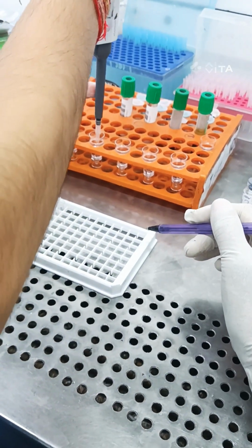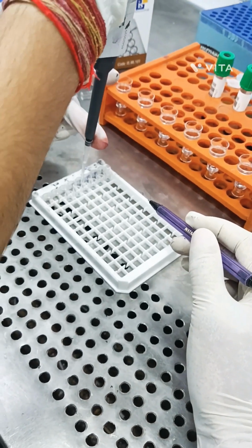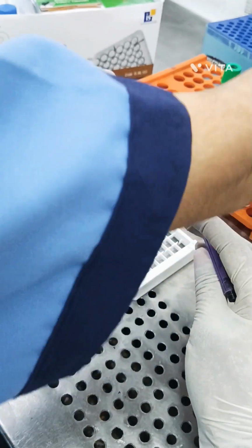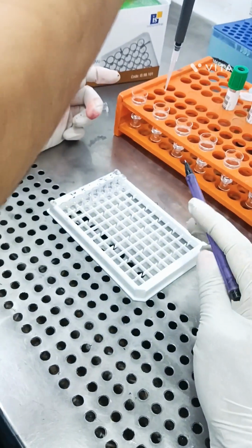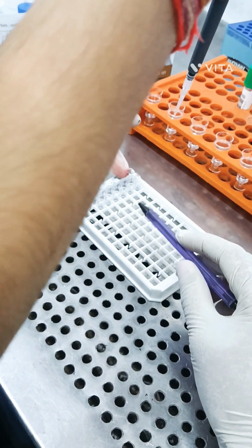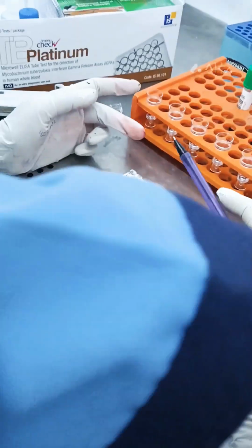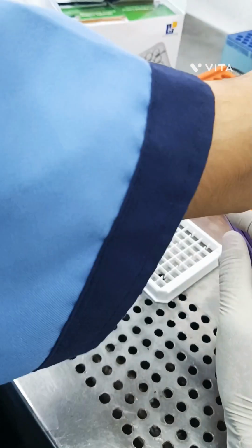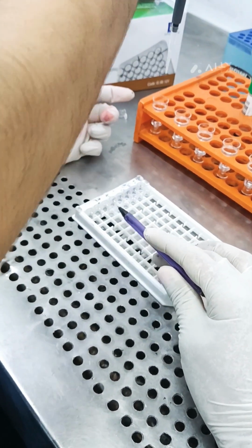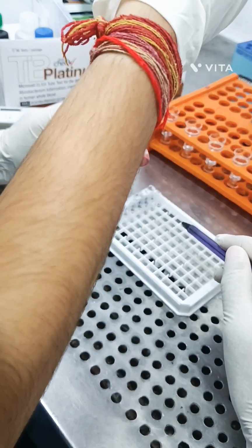Okay, then next, in the microwells, first take 50 microliter of standards 1 to 6. So first the 400 concentration take 50, then the 200 concentration take 50, the 100 concentration take 50, then 50, 25 and 12.5, the same, take 50 for standards 1 to 6.